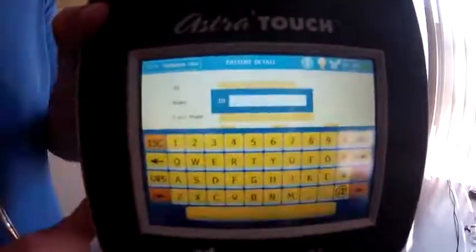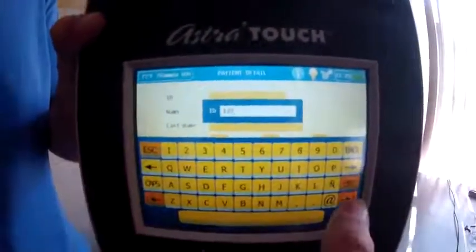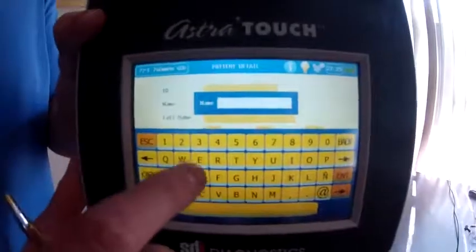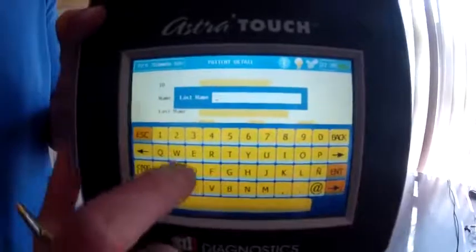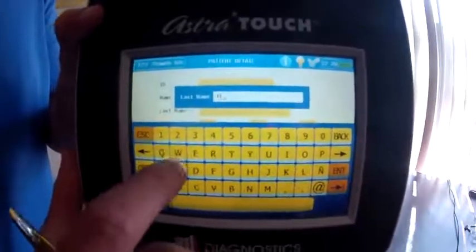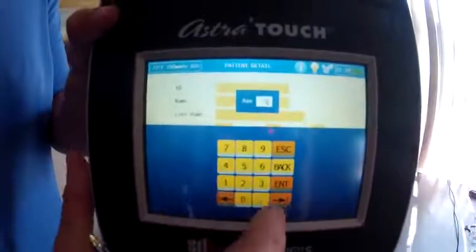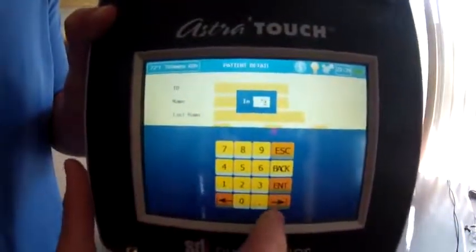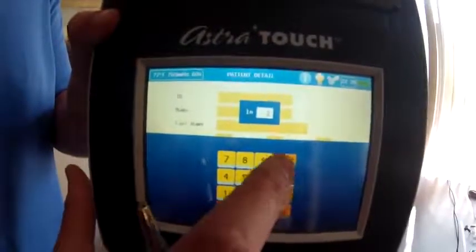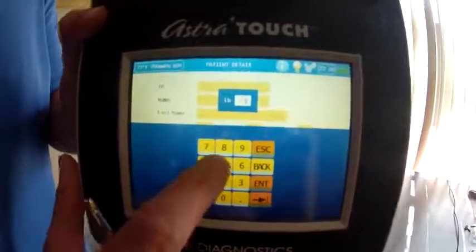I'm going to touch the first box and put in a sample number for the patient ID. Hit next, then the patient's first name — I'll put in a random name — and the last name I'm going to put as 'Test.' See how easy that is? The patient's age is 29, height in inches is 74 inches, and weight in pounds is 215.